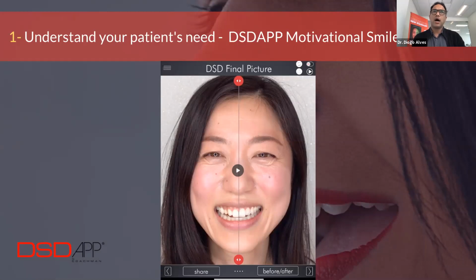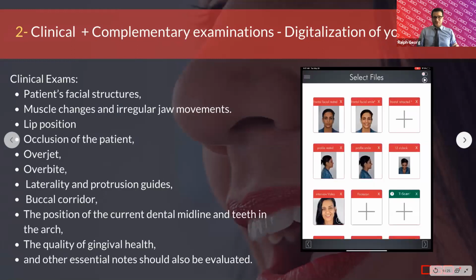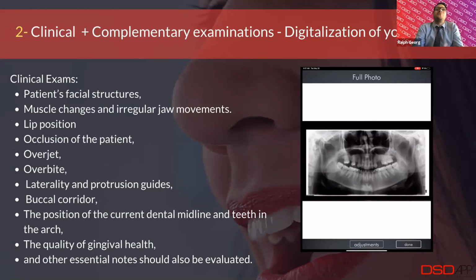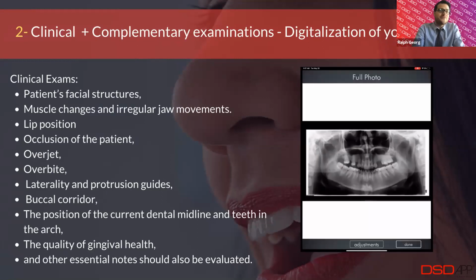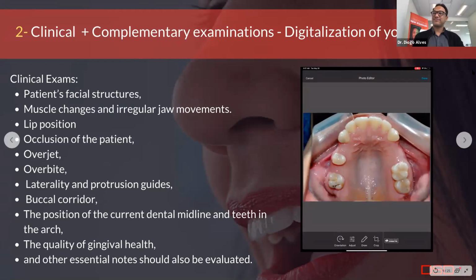I always tell all the doctors, whenever you see a patient, to whom should I do this smile design? To everybody. Everybody that comes into your practice should know that there is a potential new smile that they could have. It should be done. The UPS guy comes in to drop off the package, and you invite him in and show him. Believe it or not, that's happened before. We have had doctors whose UPS guy has come in and they've done that using the app and he loved it. And they go and tell their wife, and then it's just a great form of advertisement as well. That's great. Which you'll explain later.